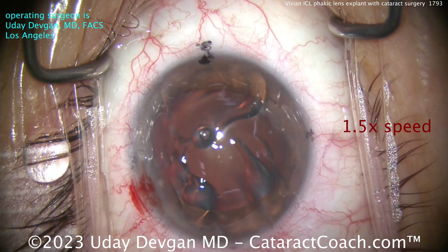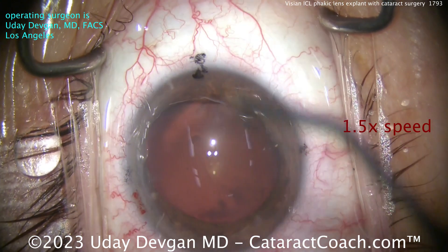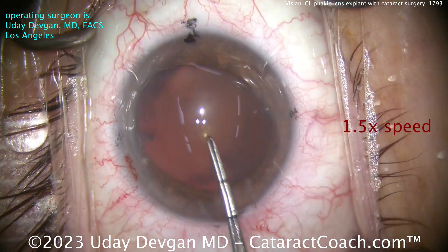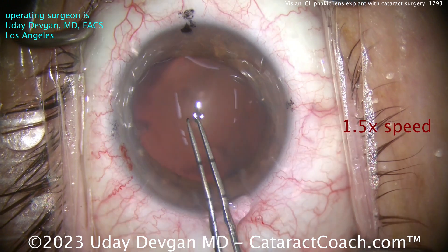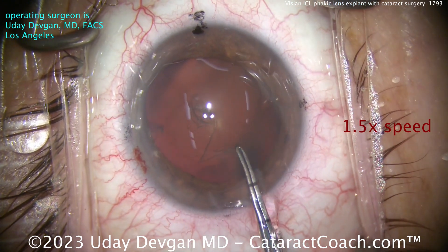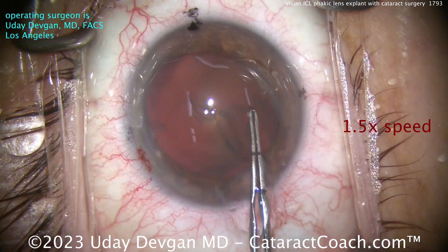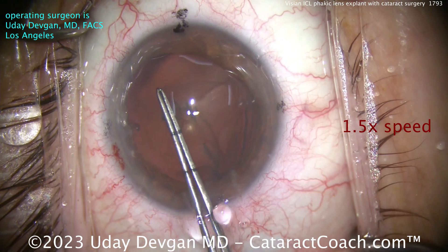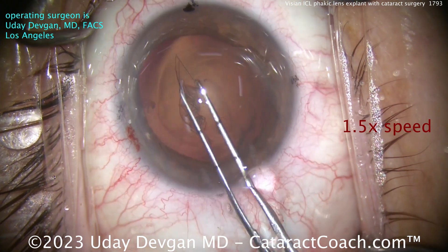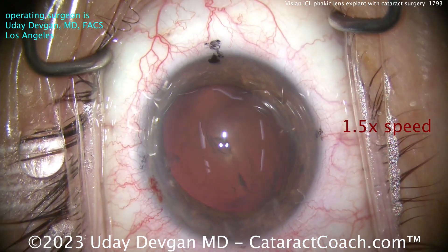Now time for the regular cataract surgery. We'll speed the video up a little bit. Let's clean off that viscoelastic from the eye. The nice part in a patient like this is we're able to put in a lens that may have more benefits than just a monofocal lens. In this case, the patient's going to get a toric EDOF lens — so extended depth of focus lens. Getting that capsulorhexis done here, very nicely. The nucleus itself is not too dense, so that'll be an easy one to remove.